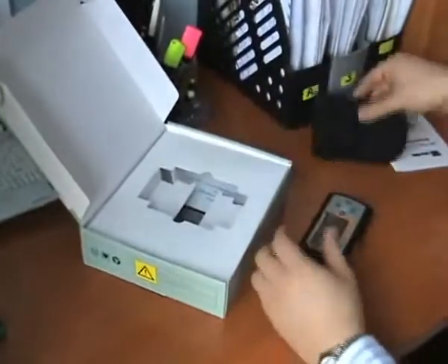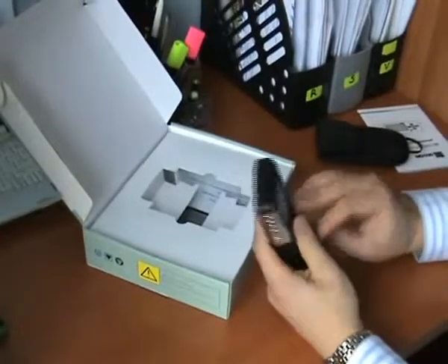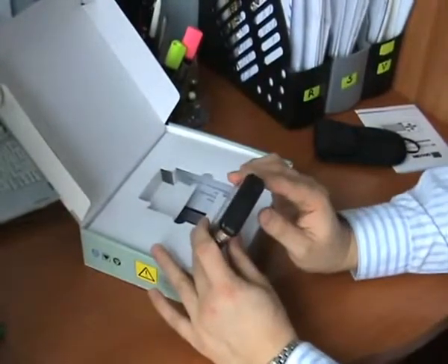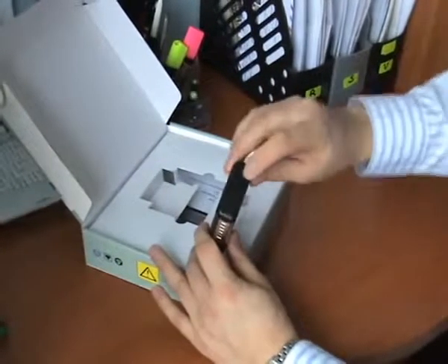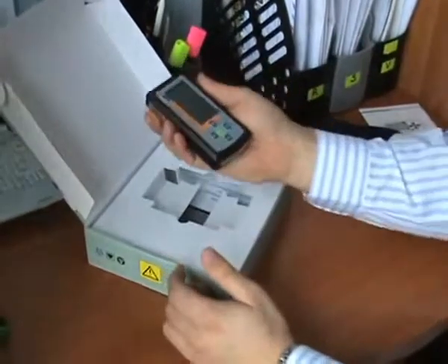Here is the user guide and some accessories which will protect your device. You can use this one-channel ECG with an additional 3-electrode cable.